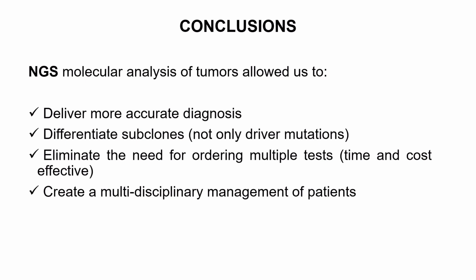Then, NGS implementation in the clinical routine could eliminate the need for ordering multiple tests, so it is time and cost effective. So consolidating multiple genetic tests into a single NGS assay saves time and resources, streamlining the diagnostic process and reducing costs associated with traditional sequential testing methods.